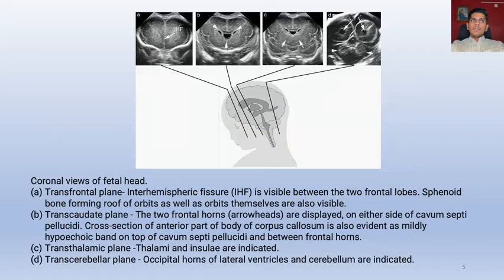In the coronal view, there are four planes used to assess the fetal head: the transfrontal plane, the transcaudate, the thalamic, and the transcerebellar plane. In the transfrontal plane, the interhemispheric fissure is visible between the two frontal lobes, and the sphenoid bone forming the roots of the orbits as well as the orbits themselves are also visible. In the transcaudate plane, the two frontal lobes are displayed on either side of the cavum septum pellucidum. The cross-section of the anterior part of the body of the corpus callosum is also evident as a mildly hypoechoic band on top of the CSP and between the frontal lobes. In the thalamic plane, the thalami and insulae are indicated.